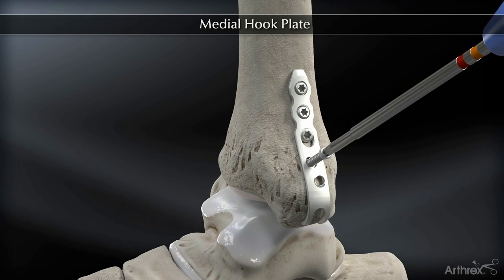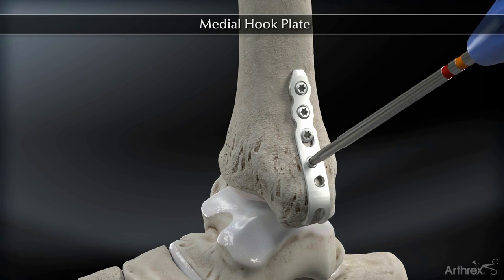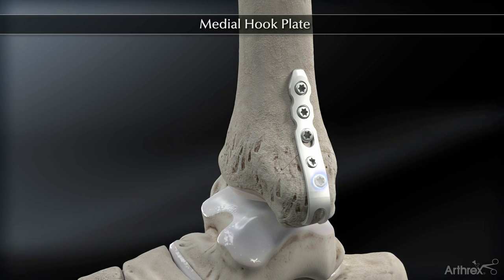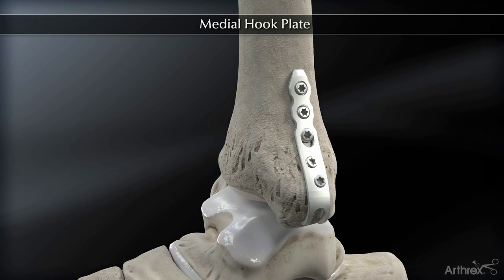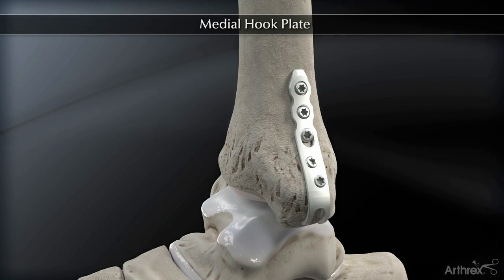Once again, this particular drill bit, drill guide, and screwdriver are color-coded for these distal screws. Distal screw placement is necessary for comminuted fractures or if there is any question of rotational stability.